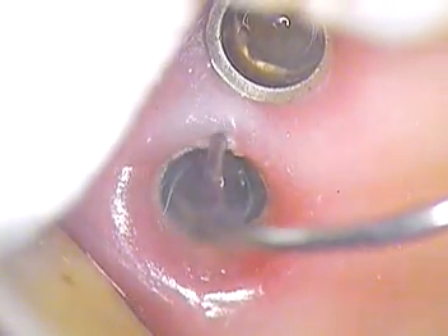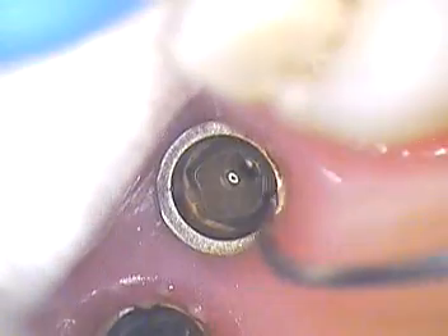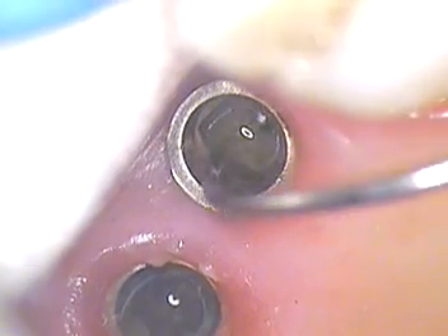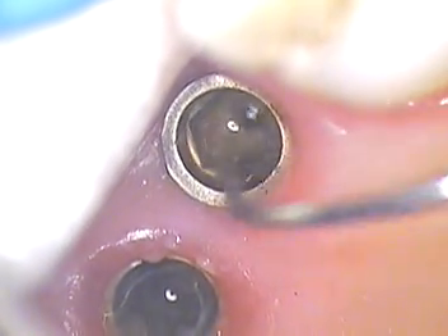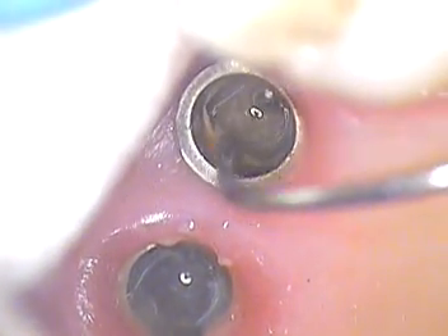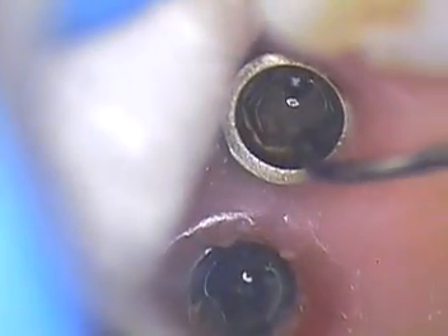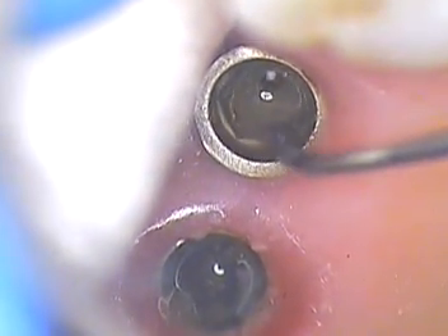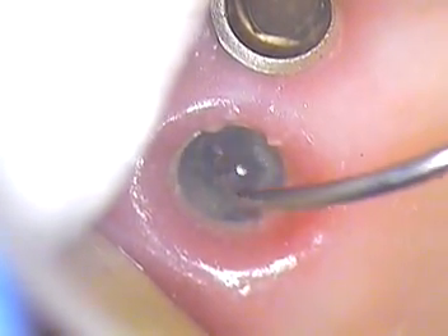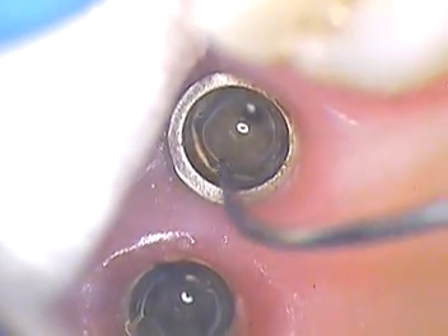Let's see what other news we have. We have nice rims, nothing's hurt. Looks like the screw holes look good. Looks like the hex is intact. I see this has been a loose case for a while. You might see a lot of aberrations and areas internally that are marred and scarred, but we haven't seen any yet. We're going to look.